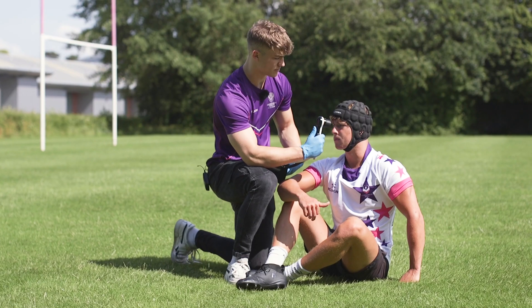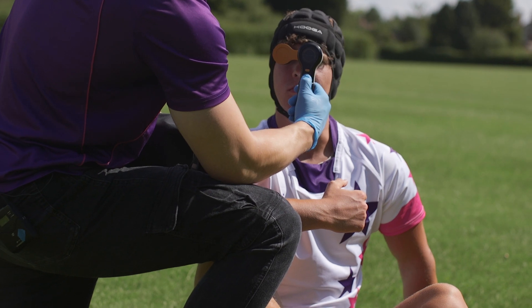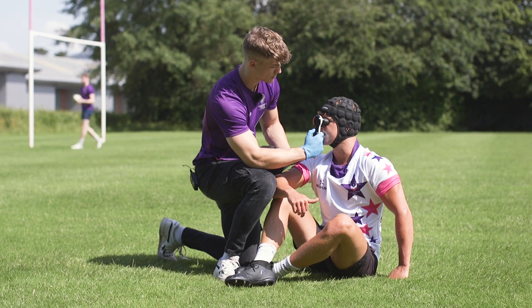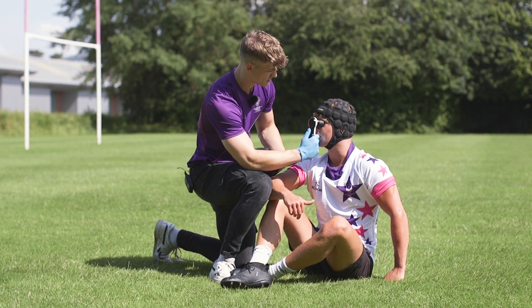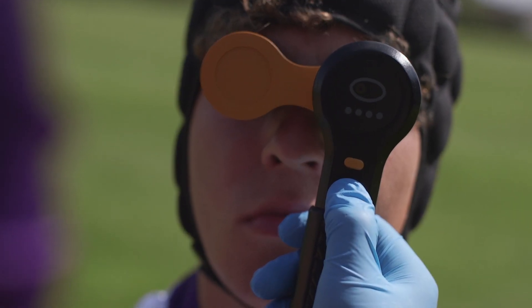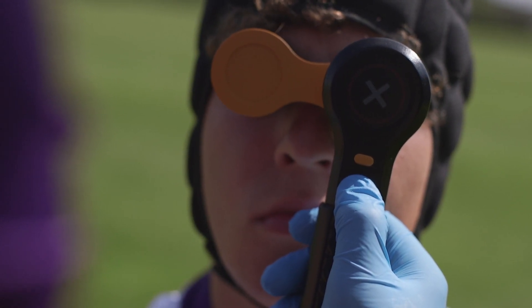Once the subject's ID has been confirmed, you hold the device up to the subject's eyes and press the action button. The process then begins — it takes 10 seconds. The white LEDs provoke a pupil response and the infrared cameras begin to record the eye's response.